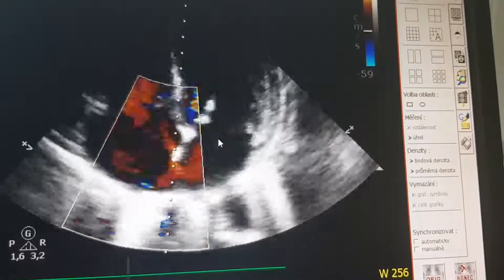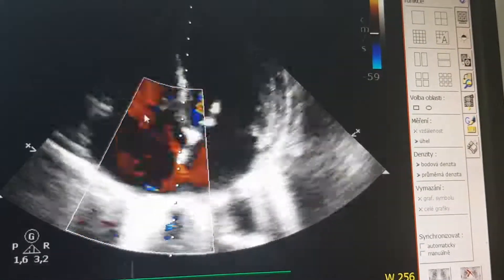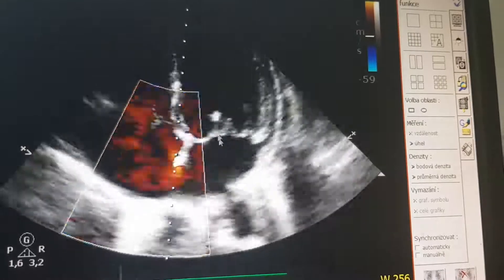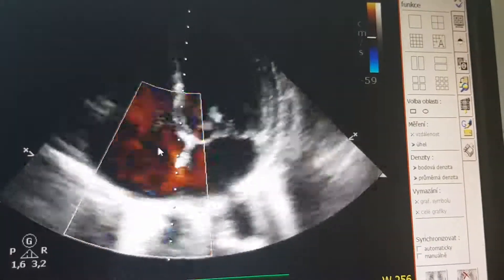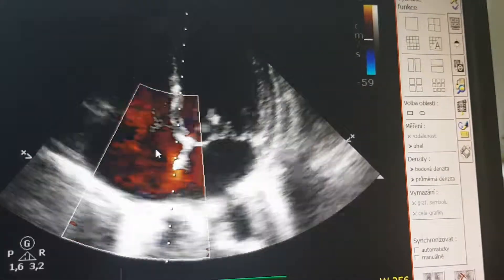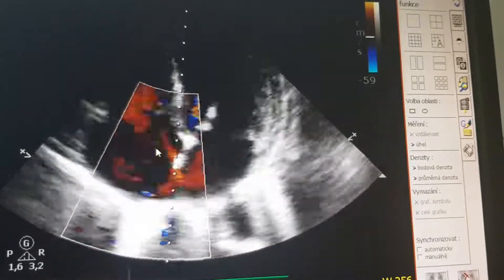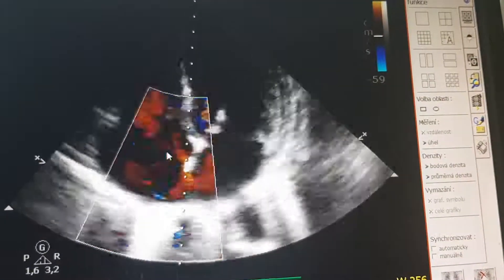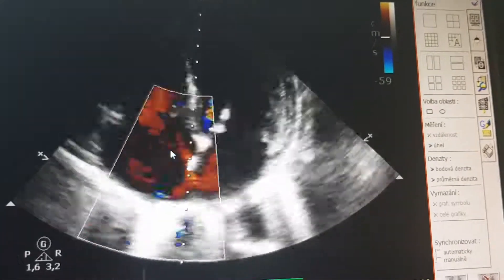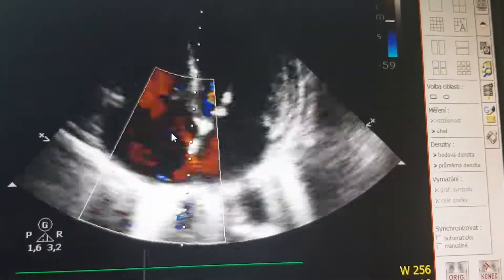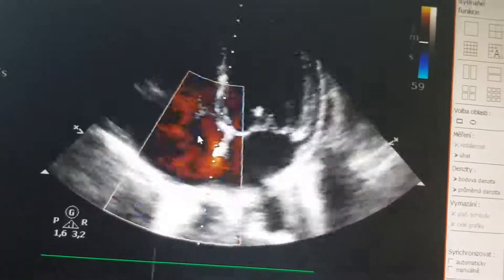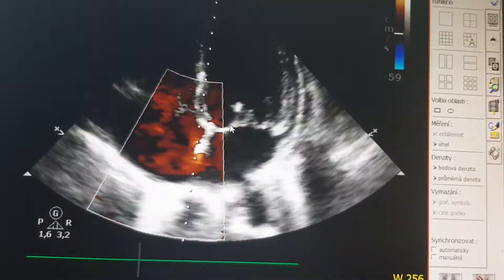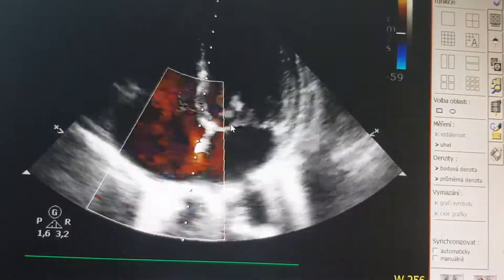There's regurgitation as you can see, but it is not that serious — it's probably mild to moderate regurgitation. Both patients had Staphylococcus aureus in their blood culture. I just wanted to show you how infectious endocarditis or vegetations look on the tricuspid valve. Thank you very much.